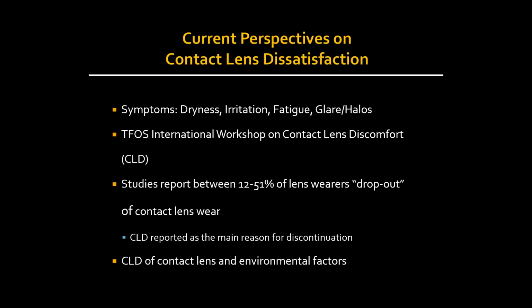So it is a condition. It is a condition that's affecting many people. But it also states that there could be the lens itself causing this dissatisfaction and this discomfort, or it is the environment. It's a complement of both. We as practitioners may be able to control more of one aspect than we can of the other, and knowing where we can make those adjustments is really how we can control the exam a little bit better.